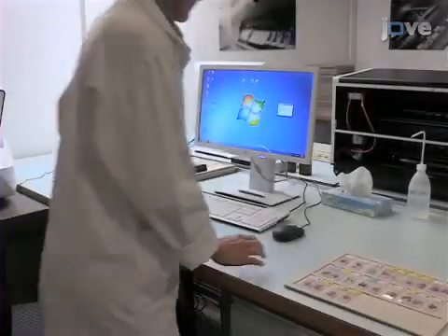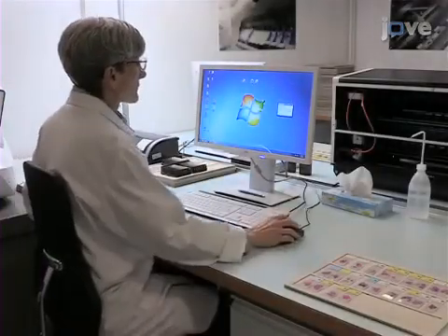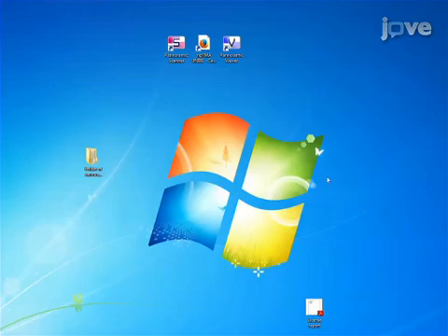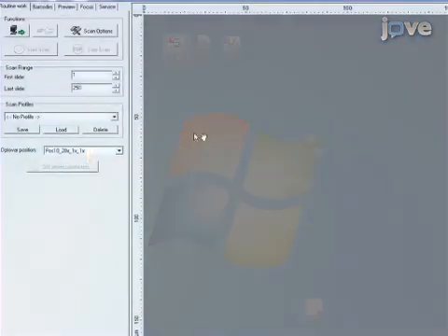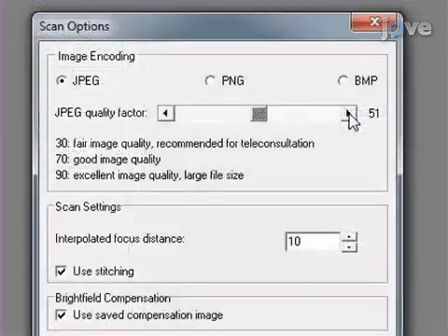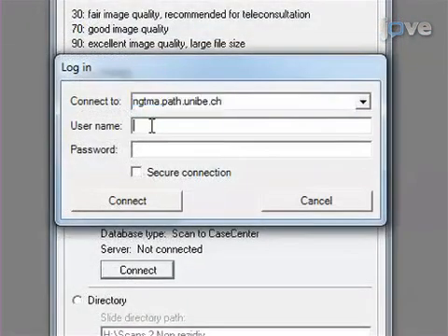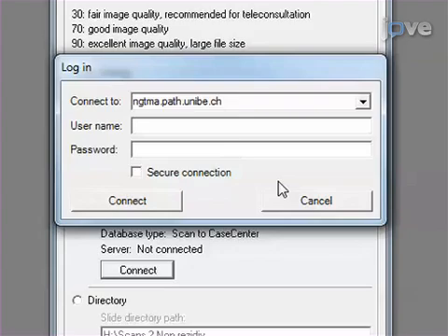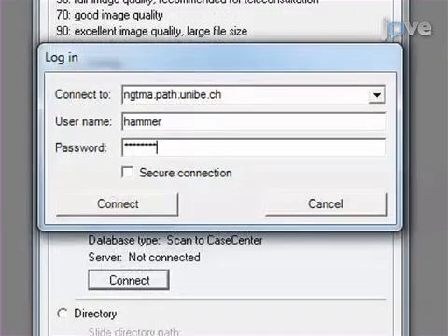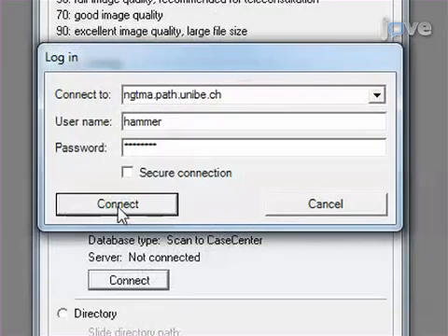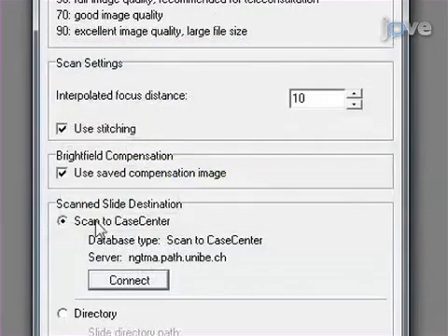Using the scanning software, first select Automatic mode for brightfield scanning. Then click on Scan options to adjust the slide quality parameters. Now choose to save the slide scans locally or to the web. Finish by clicking on Server parameters and set the scan destination to the case centre.